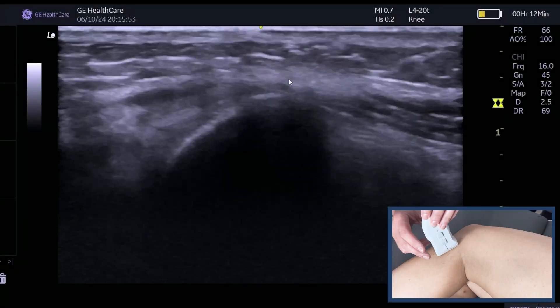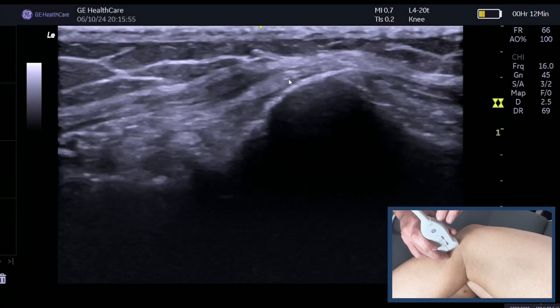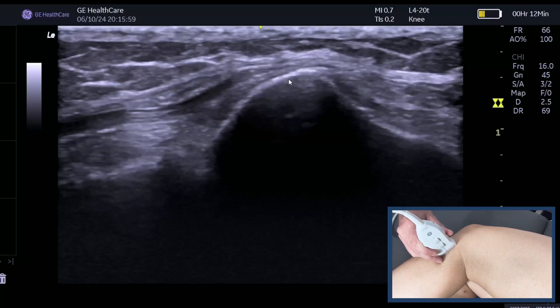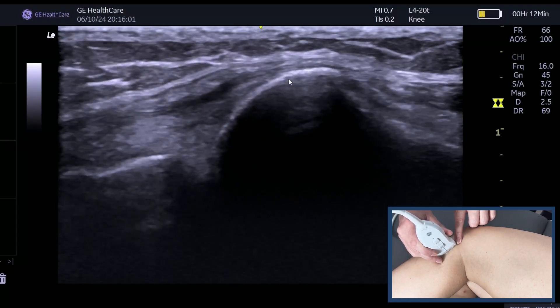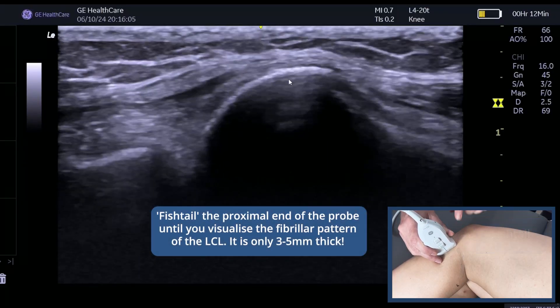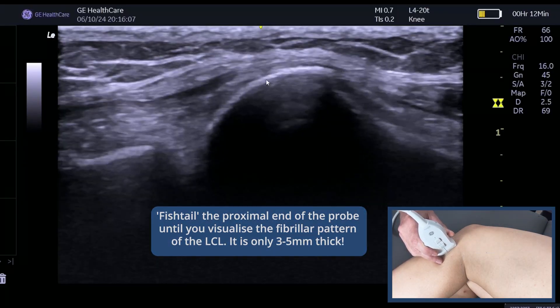So many people struggle to find the LCL. I'm going to show you how to find it in 10 seconds. Place the distal end of the probe onto the fibula head and just place that into the middle of the screen. What we're then going to do is fishtail the proximal end of the probe medial and lateral until we see a fibula pattern.